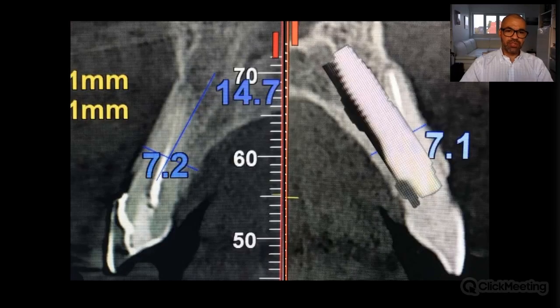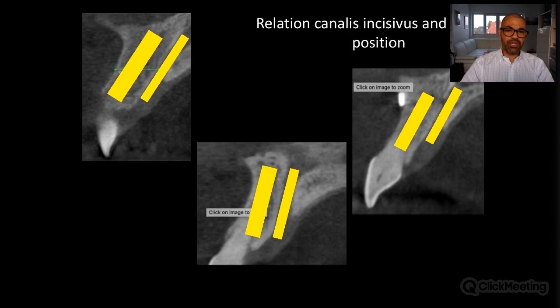In addition to that, of course, as we know from all the literature, and I assume all of the key opinion leaders in implantology have the same attitude towards it, we place the implant a little bit more palatal. So we don't want to force the implant to create too much force against the buccal plate that might cause, on a short and especially on a long-term basis, a compromised situation for the buccal plate, resulting in very bad aesthetics.